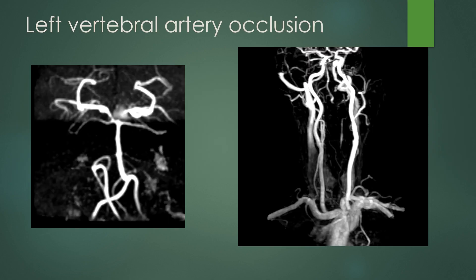On vascular imaging, looking at the MRA of the head, the left vertebral artery V4 segment looks reasonably okay; you don't see PICA, and possibly an AICA, but it's harder to tell. When you look at the neck imaging, the left vertebral artery is actually occluded at its origin with some reconstitution of flow in the V2 and V3 segments, as well as some flow in the V4 segment, which can be retrograde from the other vertebral artery.